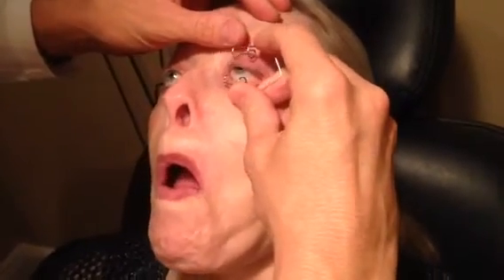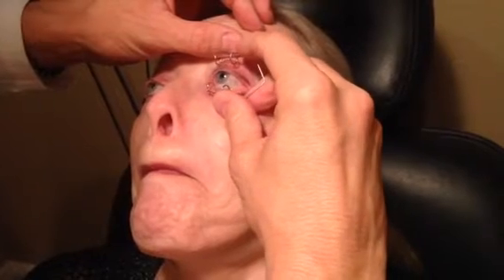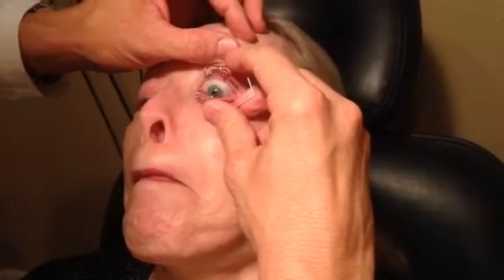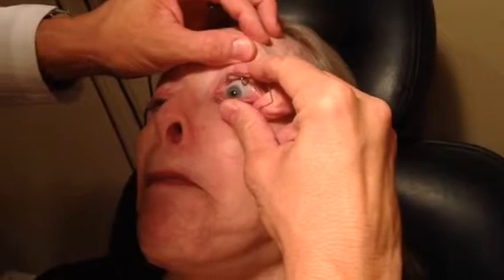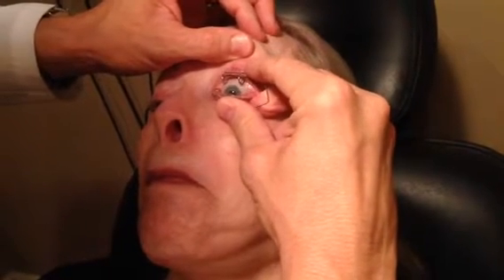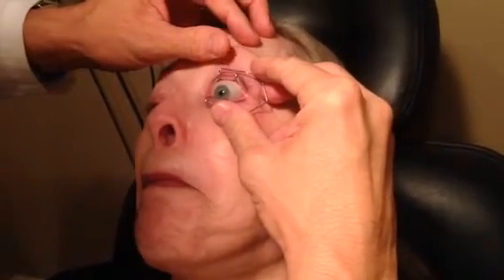Put that one in first. And then look down for me. Good. You're doing good. Gotcha. Beautiful job. Hang on. You doing okay?